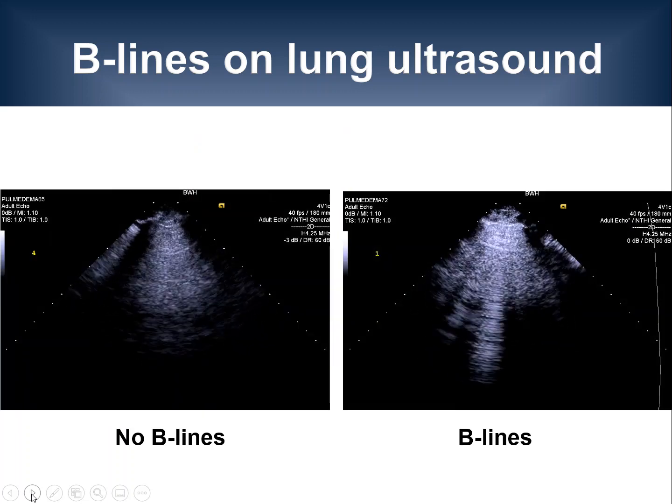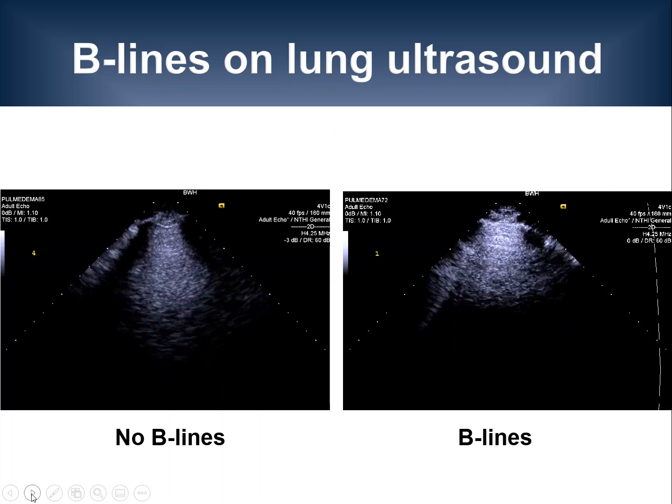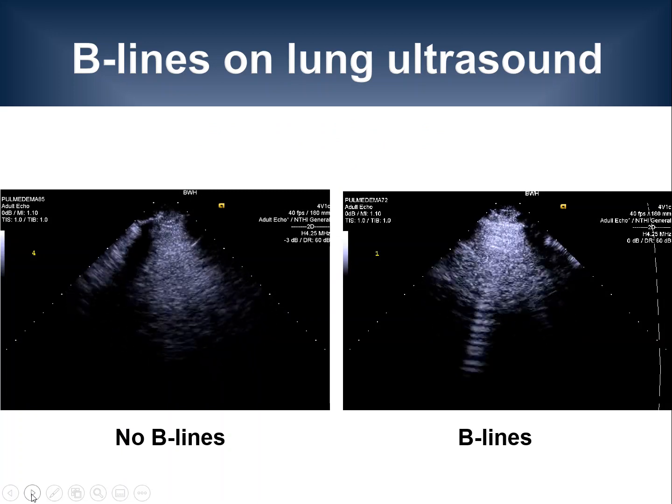Since patients are typically breathing, you can see that these B-lines on the right side move back and forth with respiration.